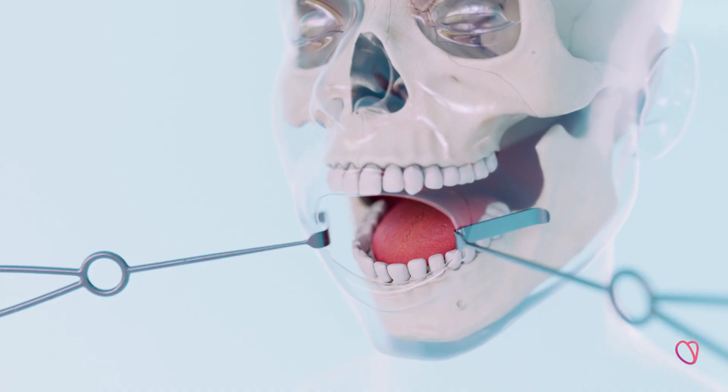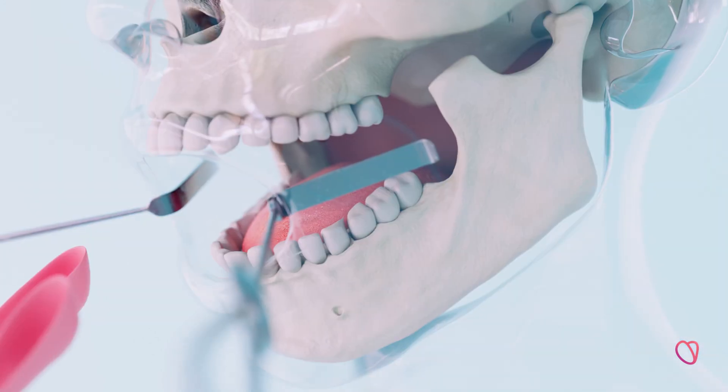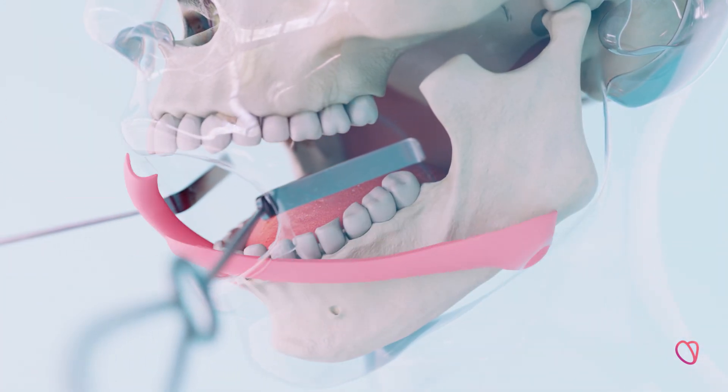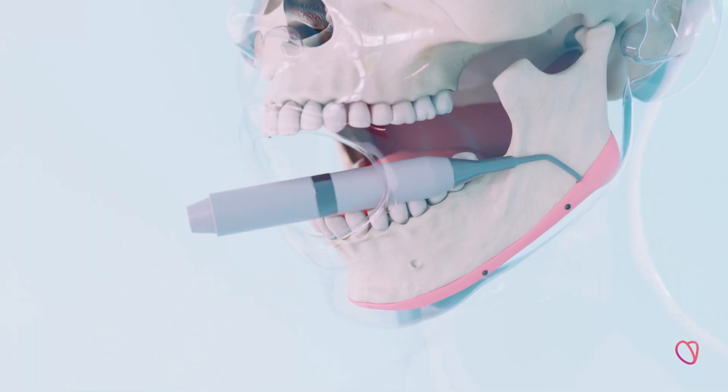Under general anesthesia, the surgeons make three small incisions inside the mouth. The cutting guide is then placed and fixed to the jawline. The bone cuts are made along the cutting guide with piezo surgery.